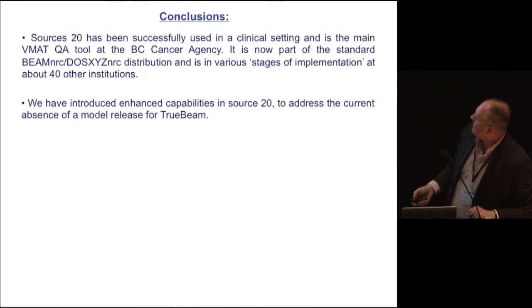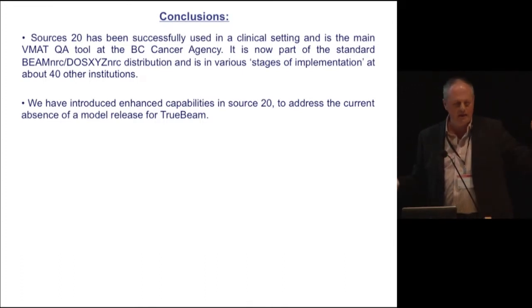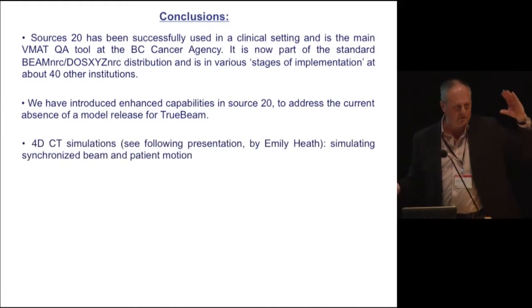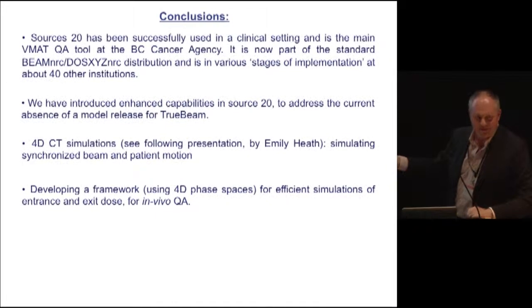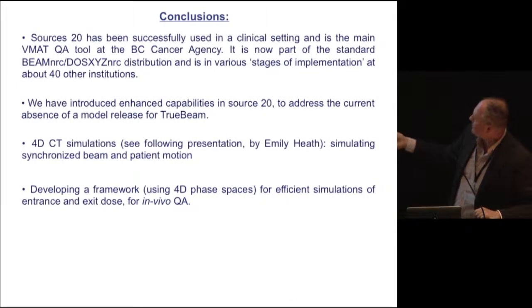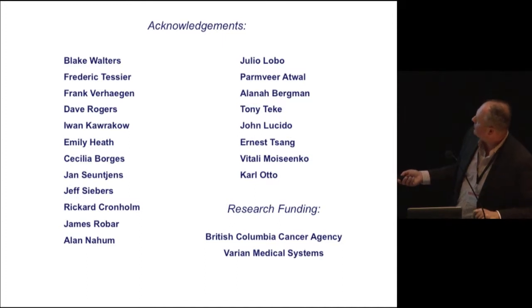And we have introduced enhanced capabilities to address the current absence of a model release for TrueBeam. I don't have to talk about it now, but at AAPM I have a presentation about how to go about absolute dose for TrueBeam, since we don't have the chamber model. I've been a champion since 2005 of using the backscatter to the monitor chamber to convert. But luckily, there is a file on the LINAC which gives us that information. And in the following presentation of Emily Heath, you'll see another example of synchronized simulations.